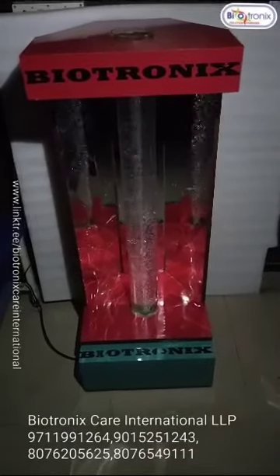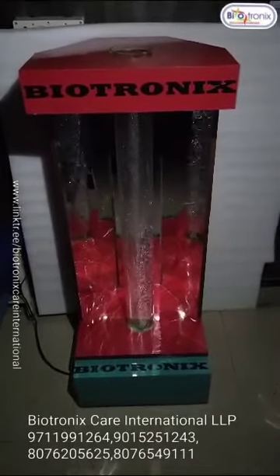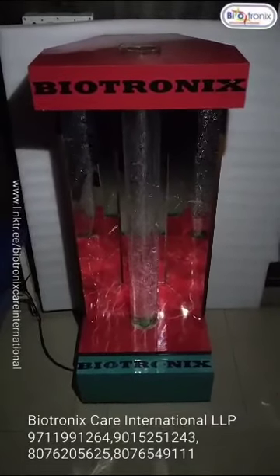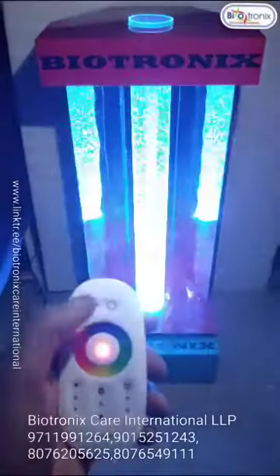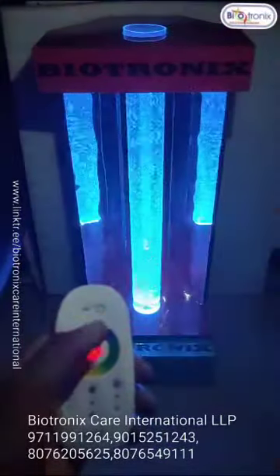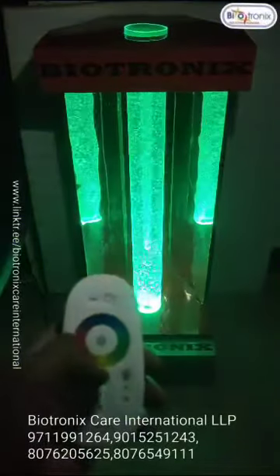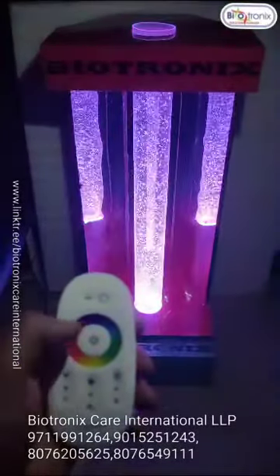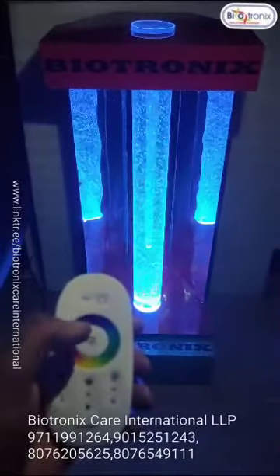This is Biotronics bubble tube with me here. You can switch on the scene, you can adjust the colors — purple, blue, yellow, red, sky blue.